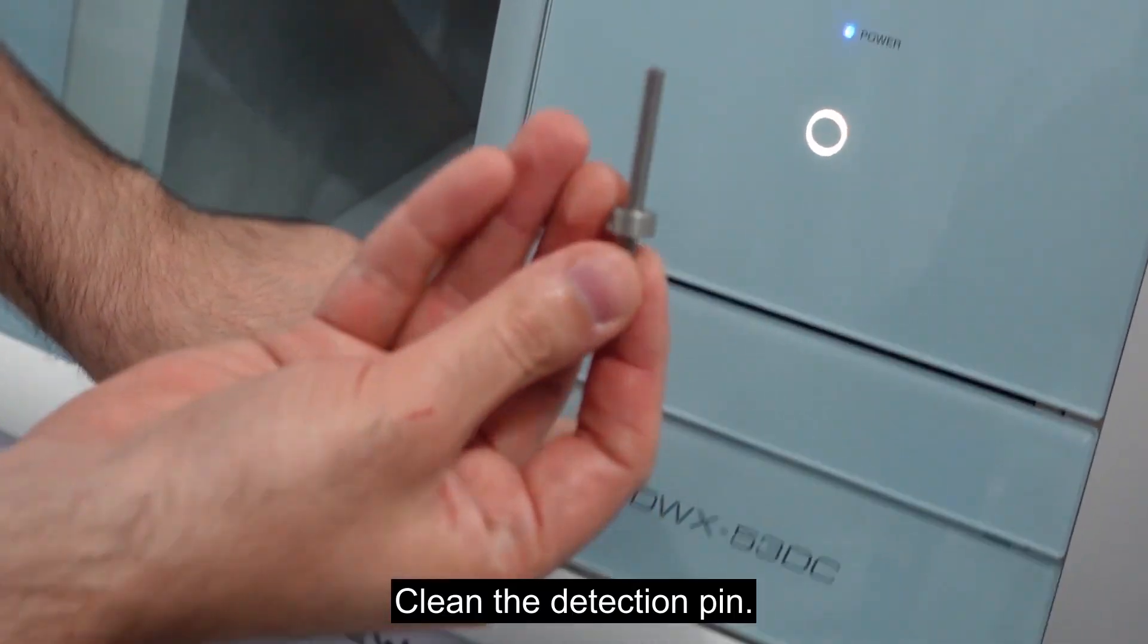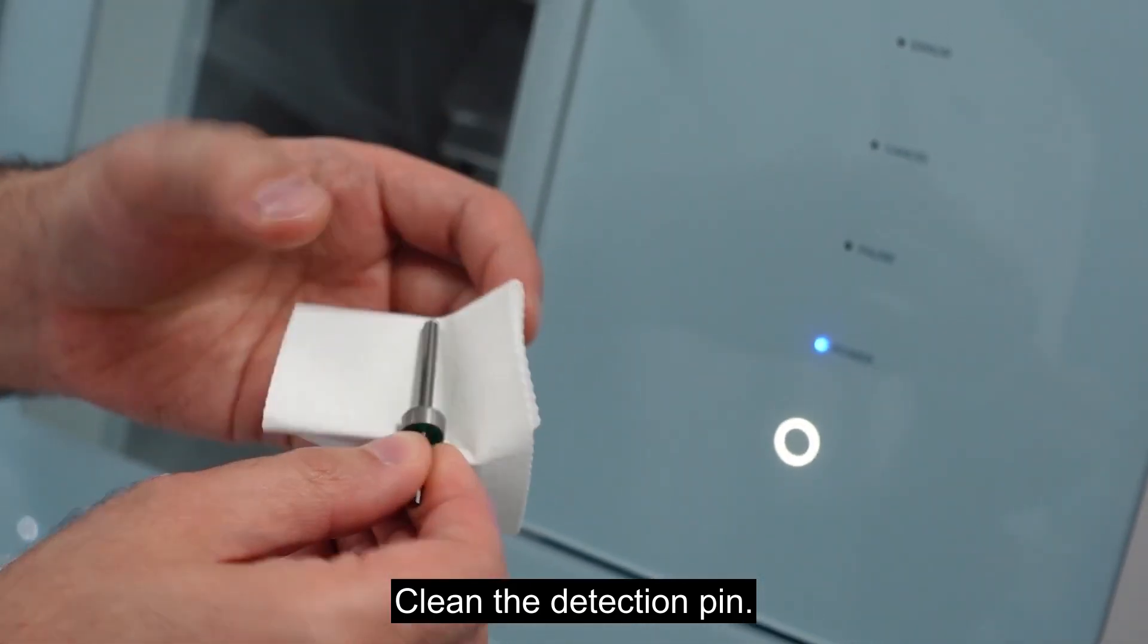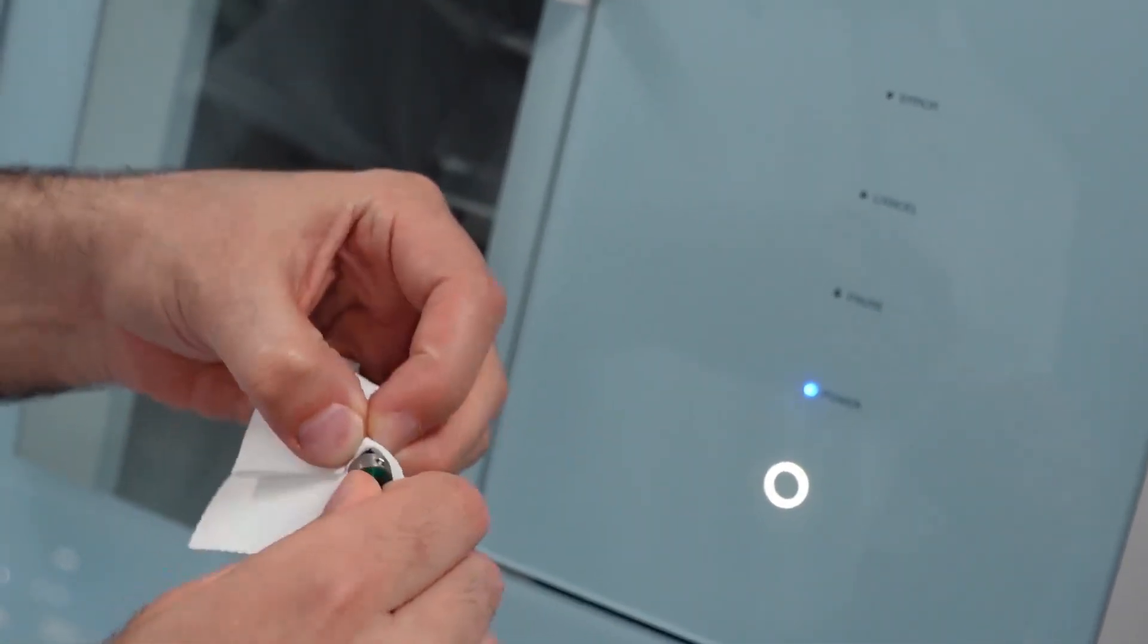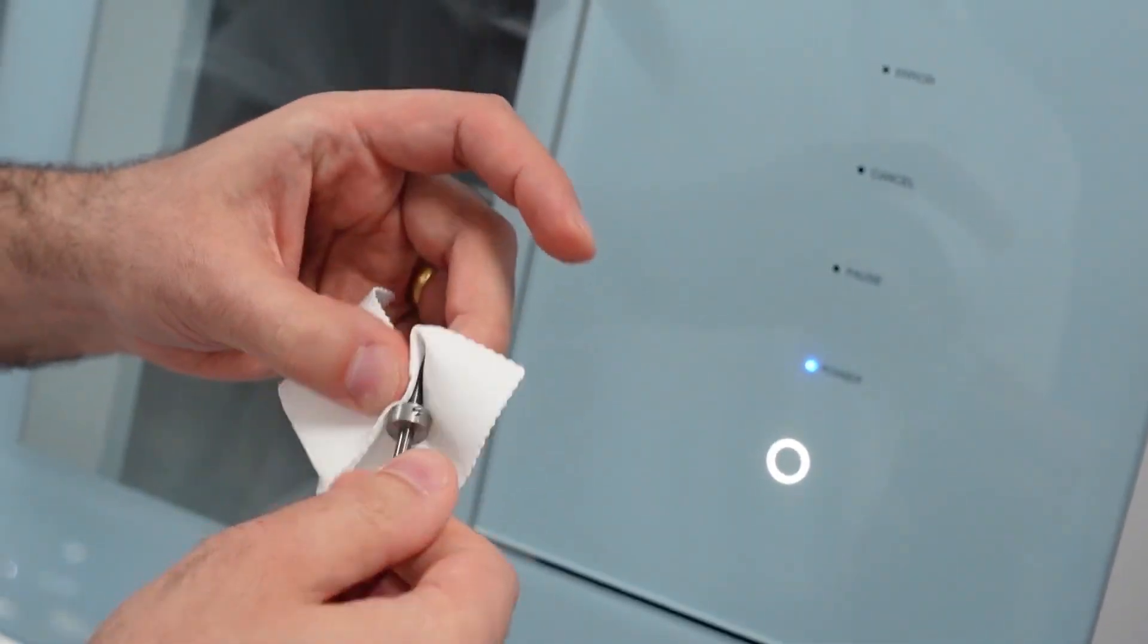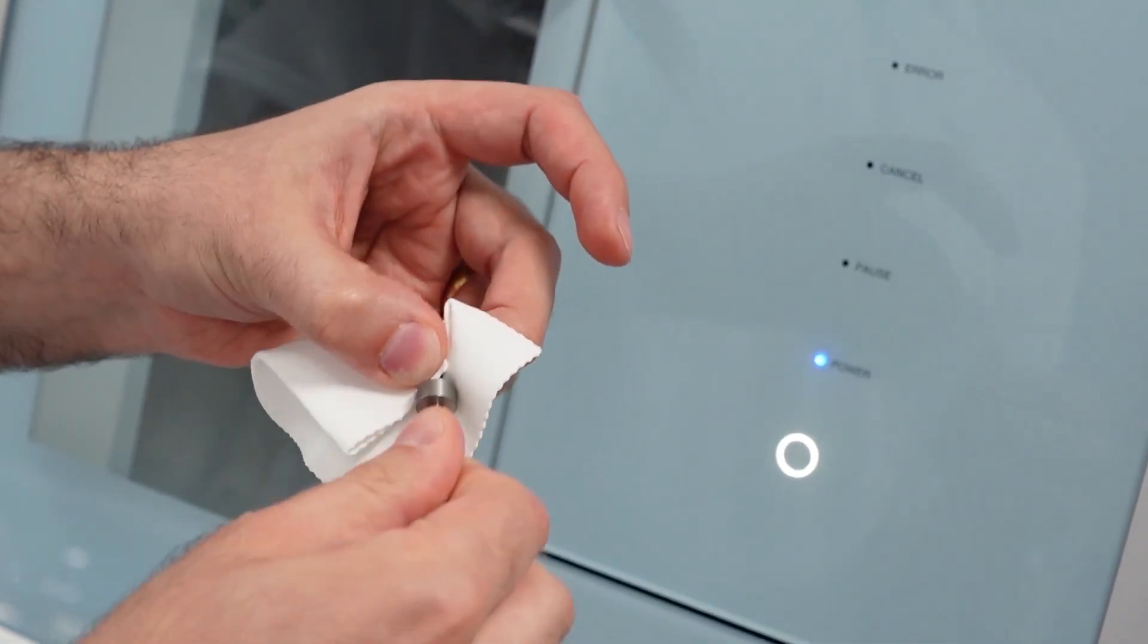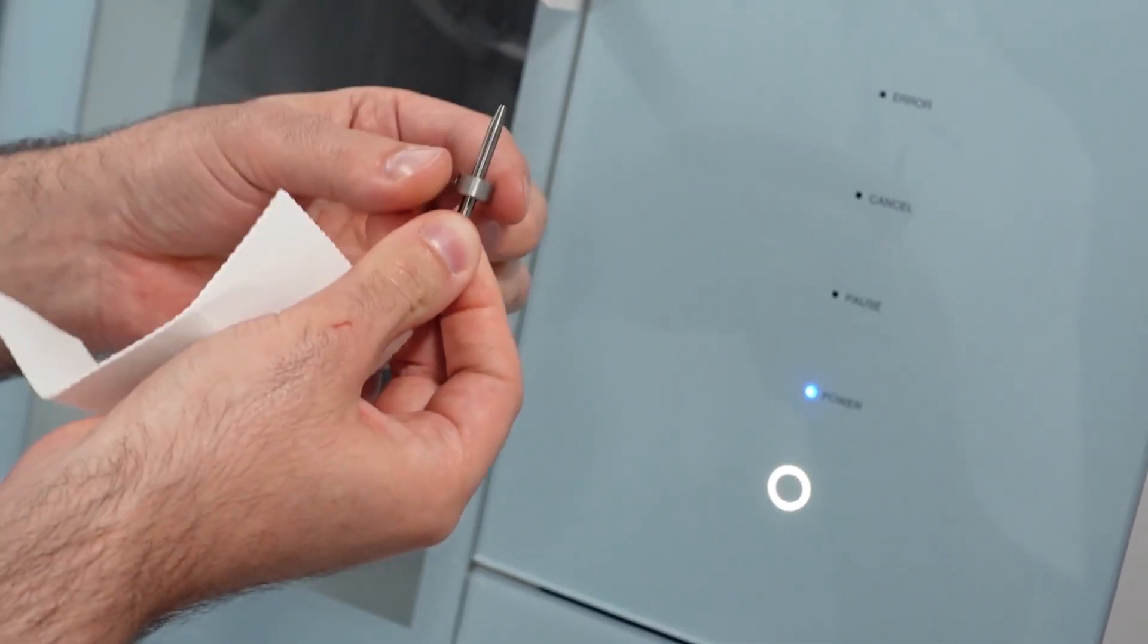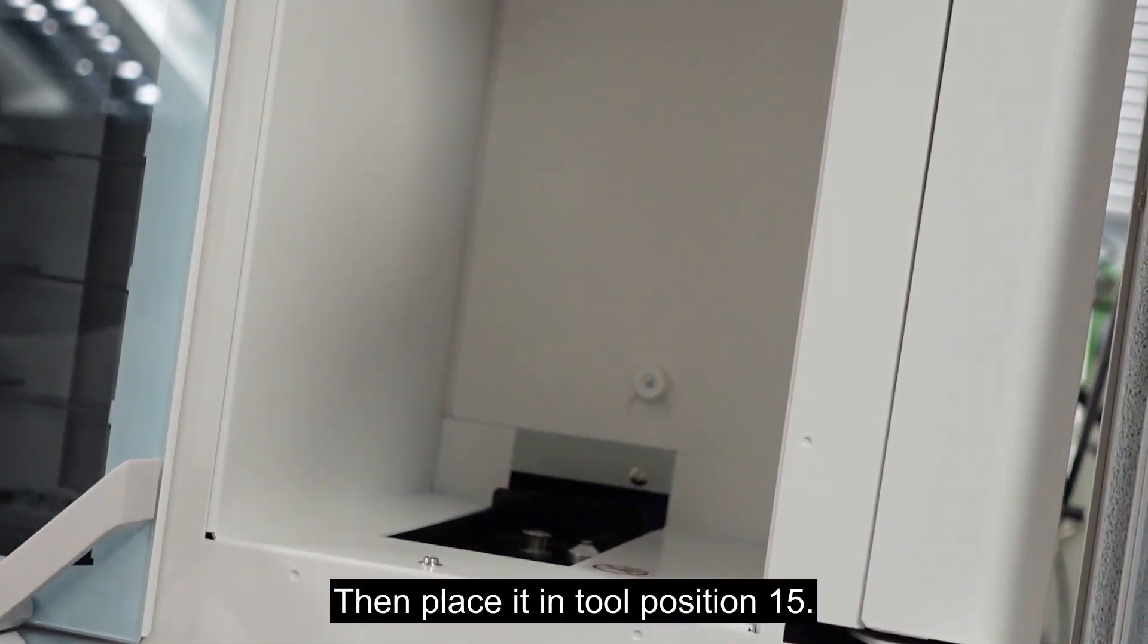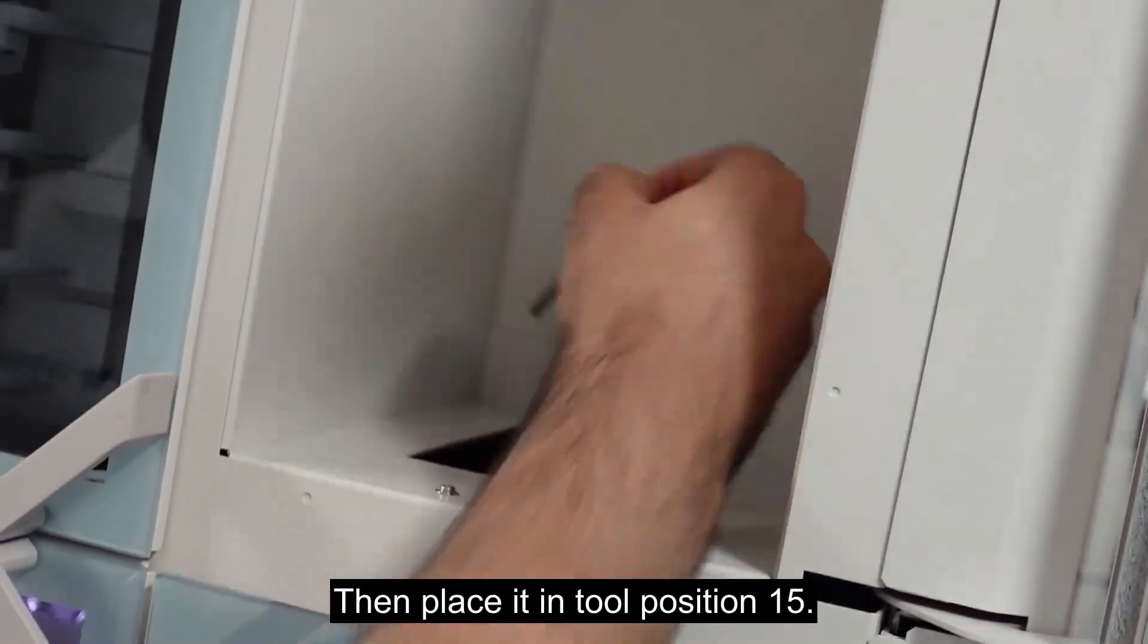Clean the detection pin. Then place it in tool position 15.